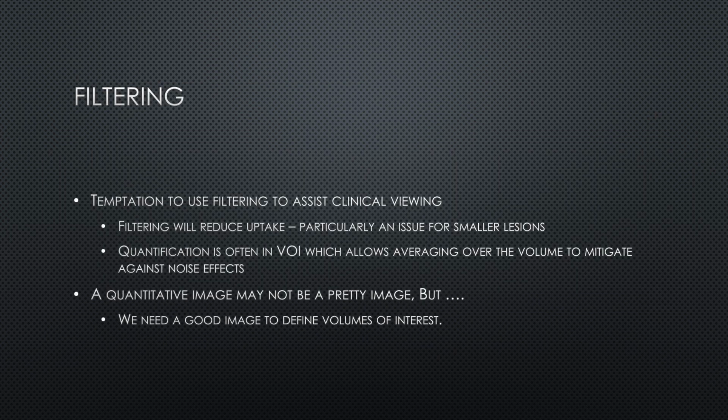To avoid noise, we can filter our imaging, and the temptation is to use filtering to assist clinical viewing, and I think that's okay. But if we apply filtering, remember we will reduce uptake, particularly in smaller lesions. As we've said previously, quantification is often in a volume, which allows averaging over the volume to try and help avoid noise effects to some extent. And again, as I've said previously, a quantitative image may not be a pretty image, but we may still need to get a pretty image to define the volumes of interest. If we have a noisy image, it can be quite challenging to define volumes of interest.